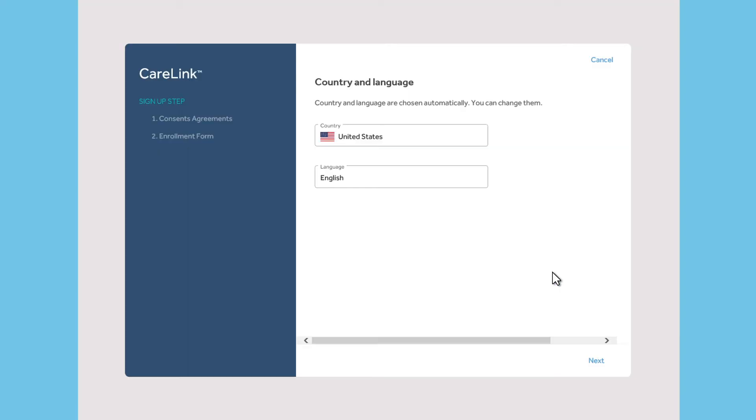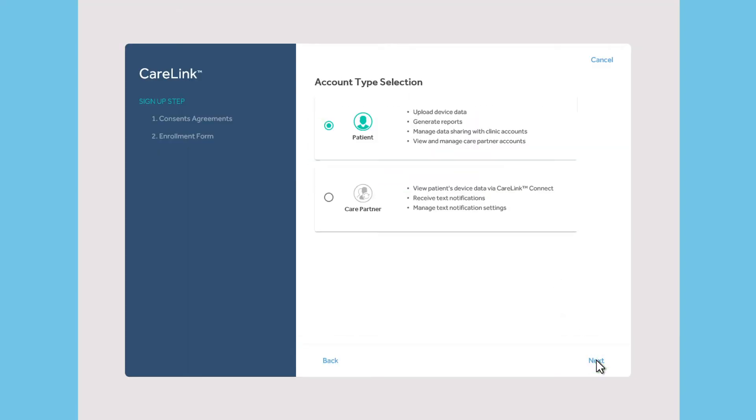First, select your country and language, then choose Patient as your account type.